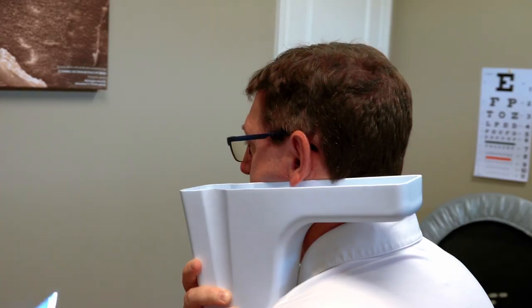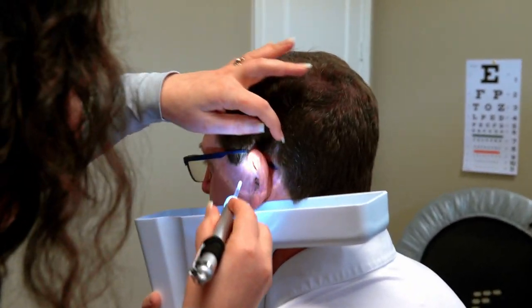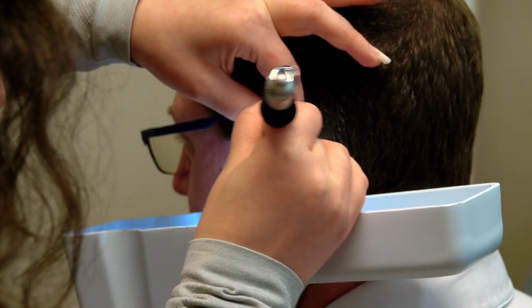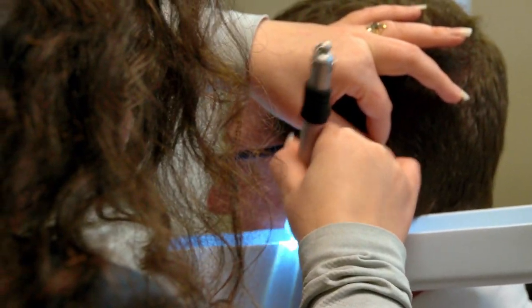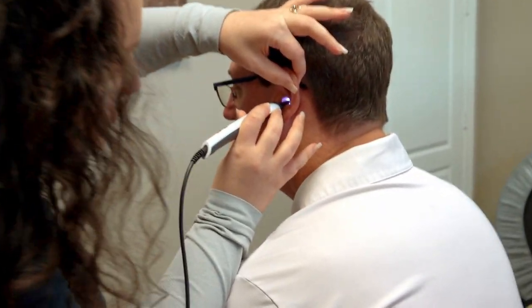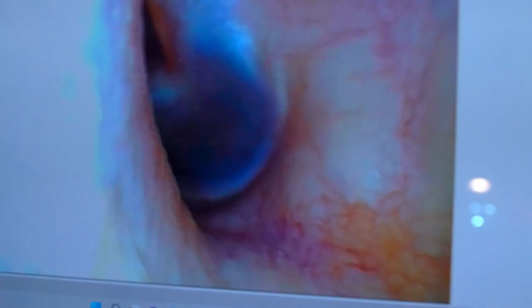It's just here on the outside so I'm just going to get it out of your ear and into the basin. Very good. So now we can see all of that wax that was in there is now gone. We can see your eardrum clearly — your canal is clear. Looks great.